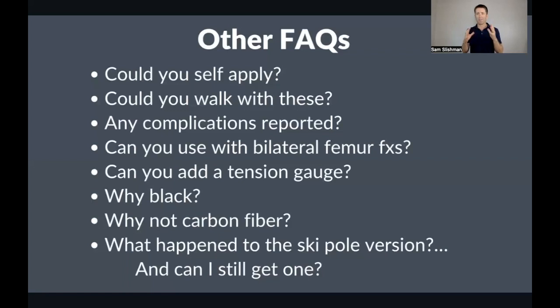So I live by treat the patient, not the numbers. I think that there's never been a circumstance where I had a patient come in and I thought, let's traction them to 11. It's just not the case. You should pull that cord until your patient says, I feel better, and then lock it in place. And then you should go back to your patient and say, do you still feel better? No, you know what? I could use a little more traction. Okay, so pull a little bit more traction. I see no value in a tension gauge. So that's the answer to that one.